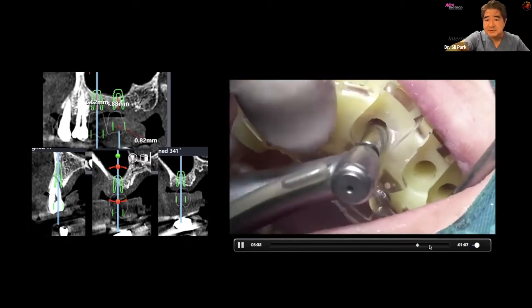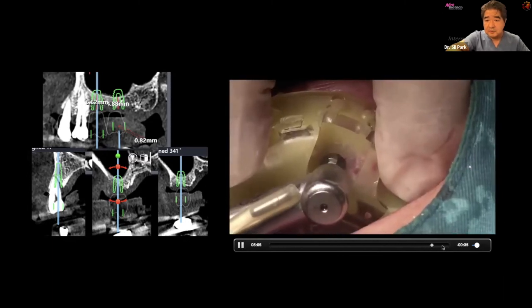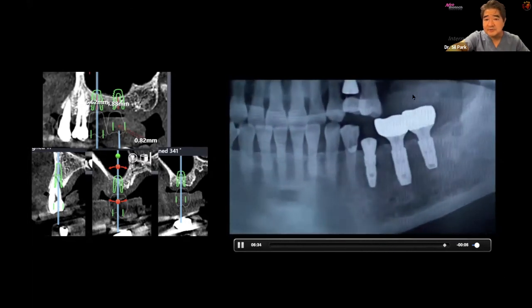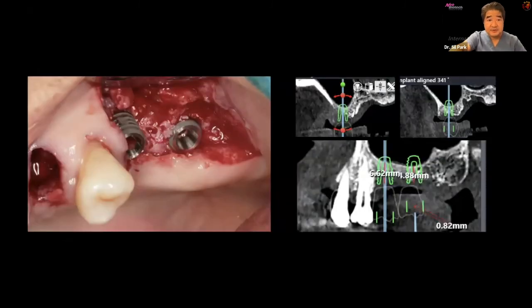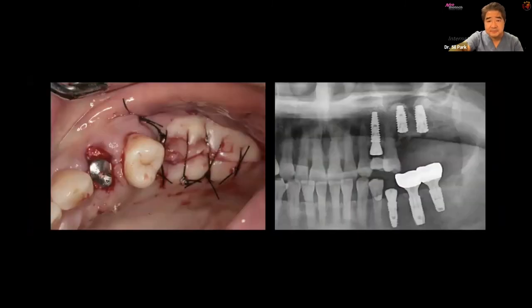Like that, let me just jump over here. So all those three implants are placed, and once the implants are placed, we put some bone graft over here, as you can see, and also the lower implant. So 1, 2, 3, with the sinus elevation, and the lower, all the case is done. All right. So this is some snapshot. The exposure on the buccal area, put some bone graft over there. So 3 implants are done, and in the mandible, 1 implant is done for this case.